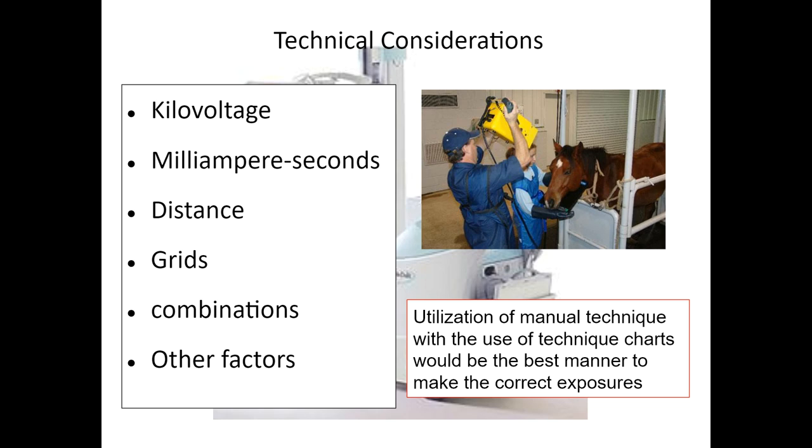You know, the basics, as you've seen in the lab here, are still the same. You still have kV. You don't have much power over the time of the exam, right? So you just set the mAs, which incorporates time, but you can't actually change it, right? You can't change your mA or your time. You can only change mAs. You hope that it has a fast time, right? That whatever mAs you're using is a combination of higher mA and lower time, because motion can be an issue on any exam, but, you know, repeating a portable, even if it's like a legit repeat, is still tougher than repeating an exam that's already in the room, right?